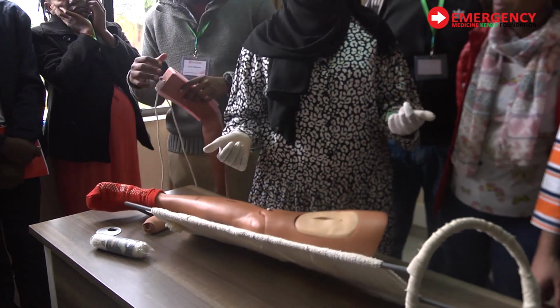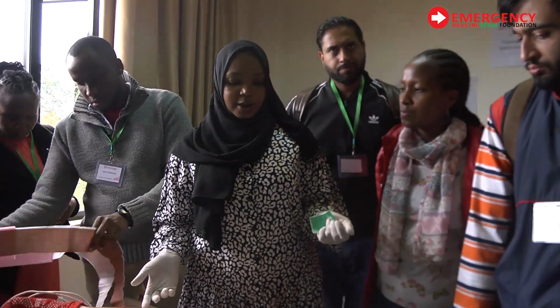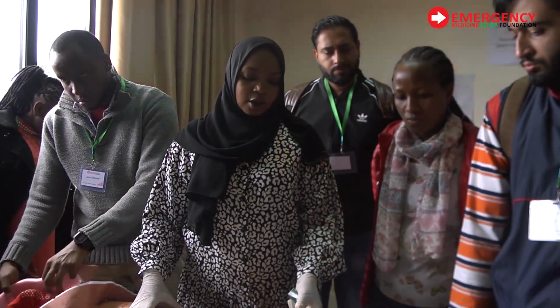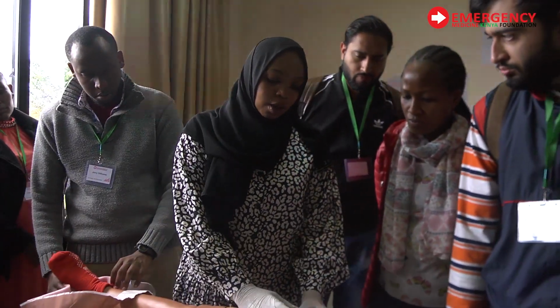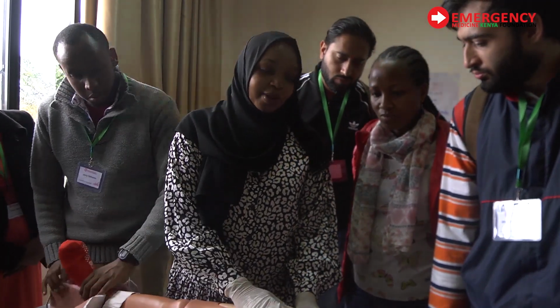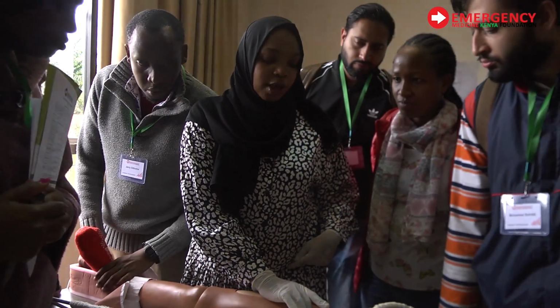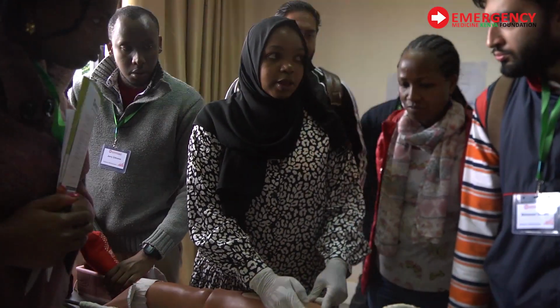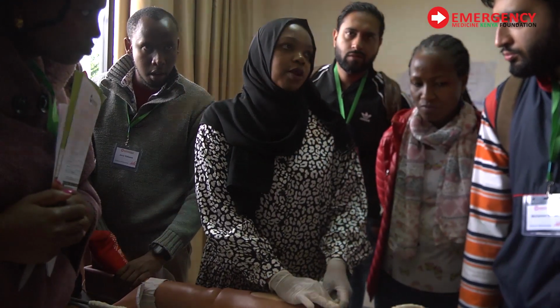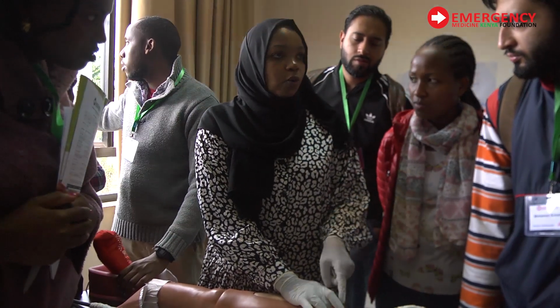We don't have orthopedics, we don't have ORIF, which can take almost a week or two to be done. So you just do that. About the nerve block, I don't know if anyone is willing to be palpated. When you palpate, even for yourself, you'll see the femoral artery. Medial to it is the vein. Lateral to it is the nerve. So once you palpate, you feel the artery, you go to the nerve.